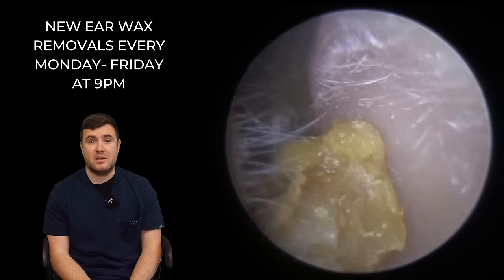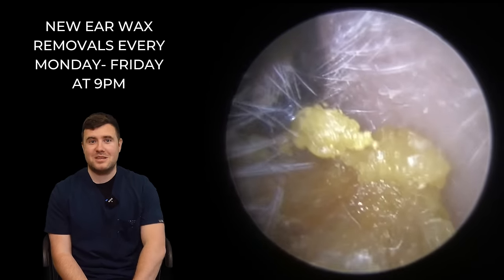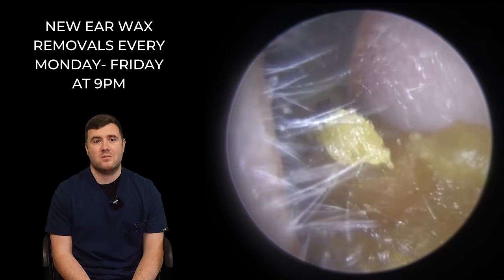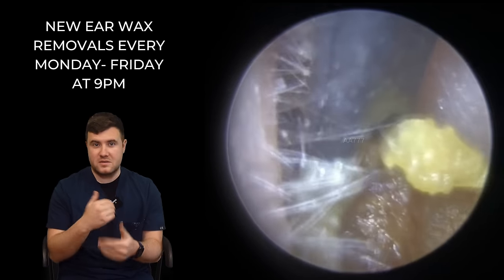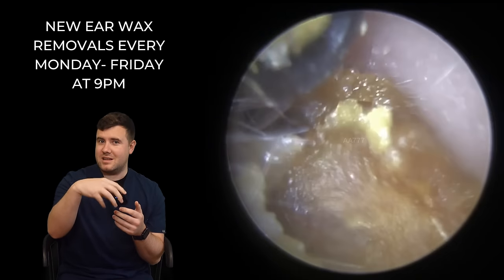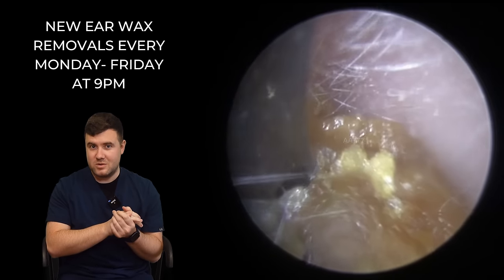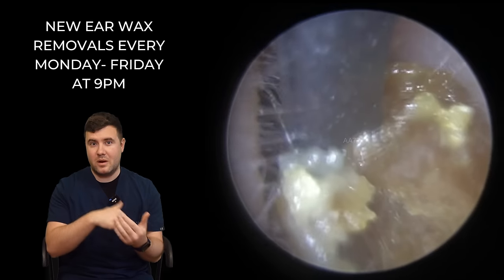So a Jobson's horne is coming into play here now, which is quite nice to see — we don't really see it on the channel these days very often. We're going to pop in and try to nip in just behind this plug of wax, and basically try to roll this forwards. You can see where this deeper section is a little bit more on the soft side. We've just started creating a little trench in this now, so we're going to need to try and dig the Jobson's horne into the wax to start moving this whole plug forward.